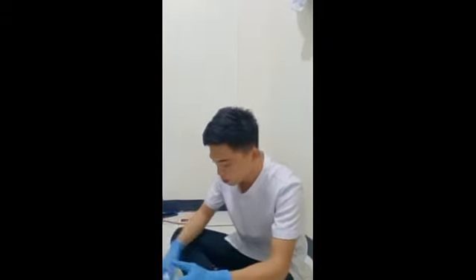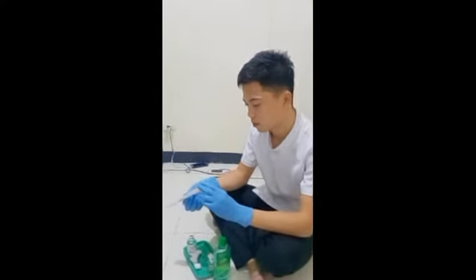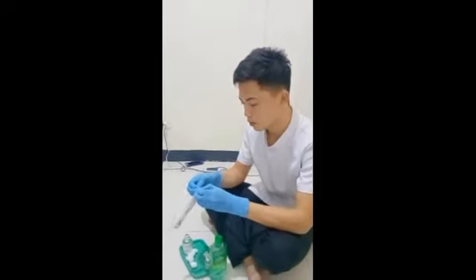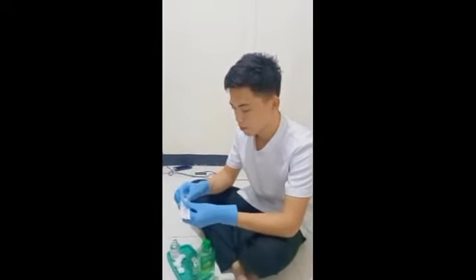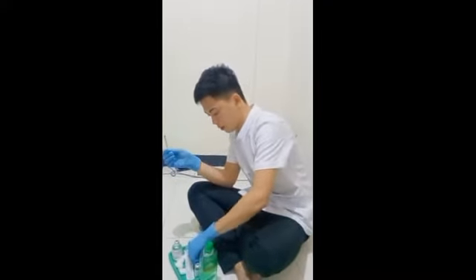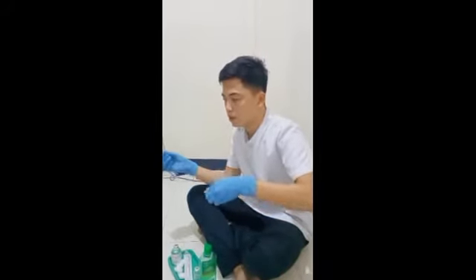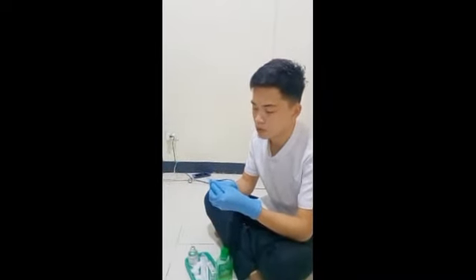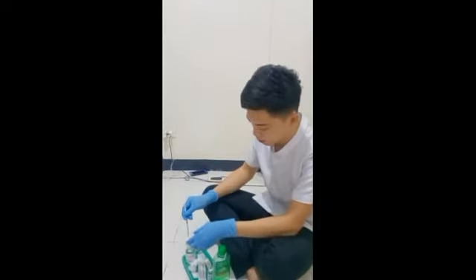So we need to aspirate, also open the syringe. Open the syringe. So this one. And open up, and check the air bubbles. So you need to dilute.